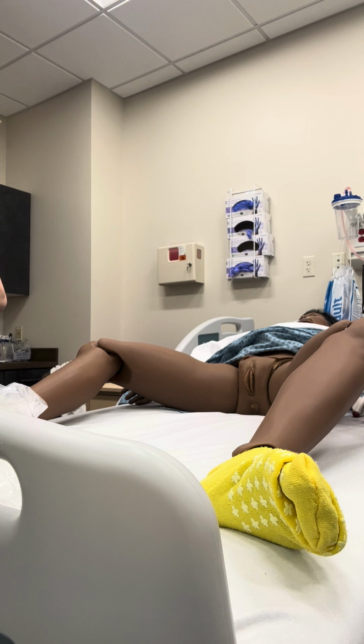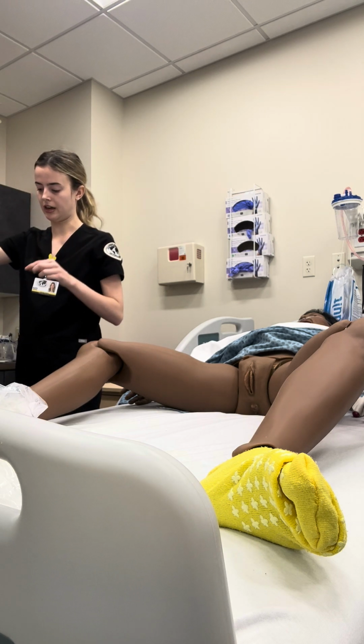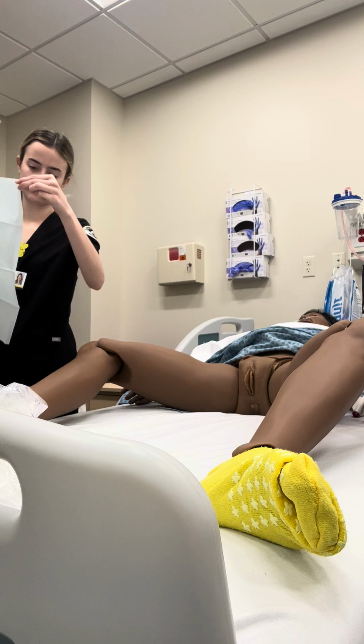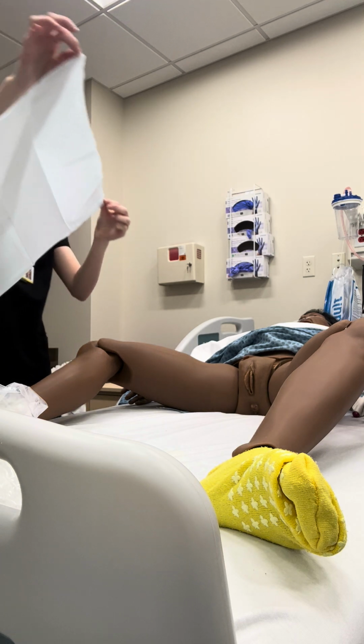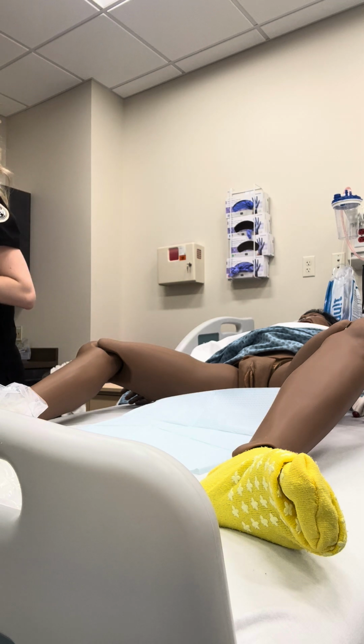Okay, and then I'm going to take this drape and I'm going to lay this drape right here in between your legs, shiny side down, okay? And then I'm going to put on my sterile gloves.